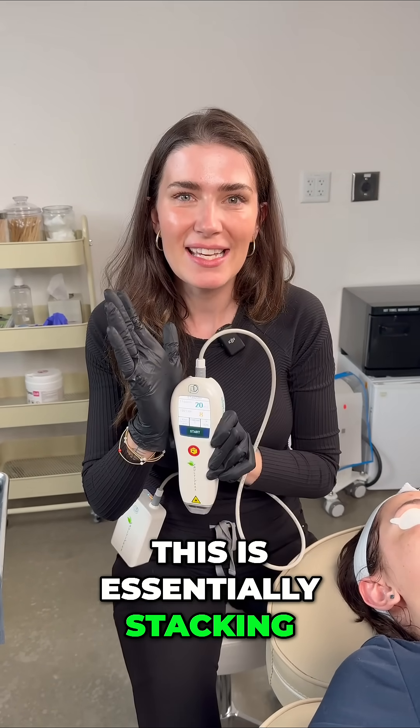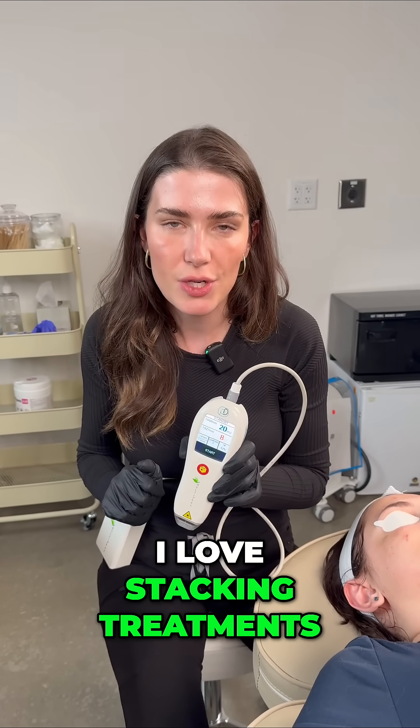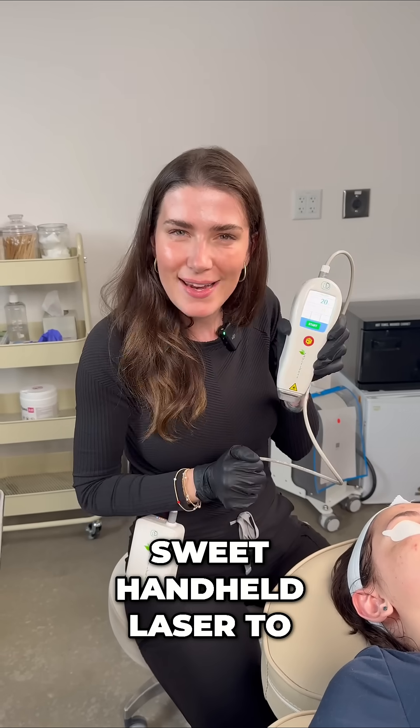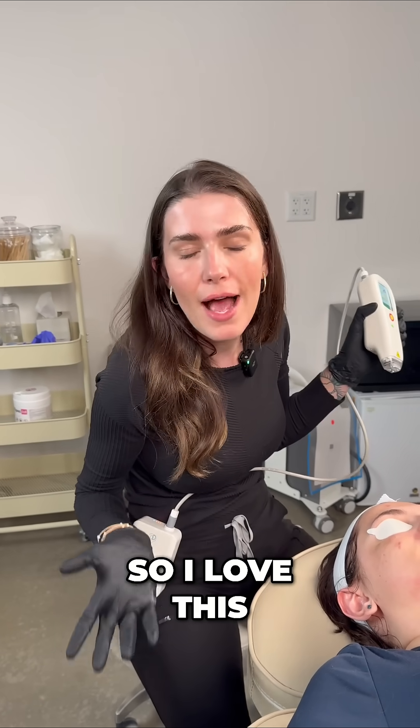This is essentially stacking. And if anyone knows me as a practitioner, I love stacking treatments. So having this little sweet handheld laser to stack treatments all at the same time is remarkable. I love this.